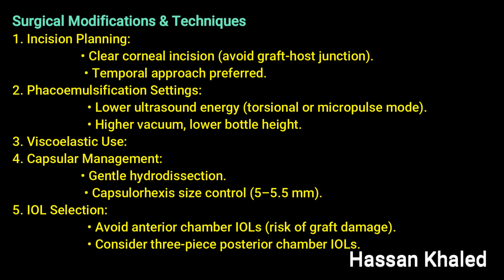Surgical modification and technique: incision planning should be at the clear cornea, away from the junction between the graft and the host, and a temporal approach is recommended. Do the phacoemulsification with lower ultrasound energy and higher vacuum, using dispersive OVD all the time during the surgery.